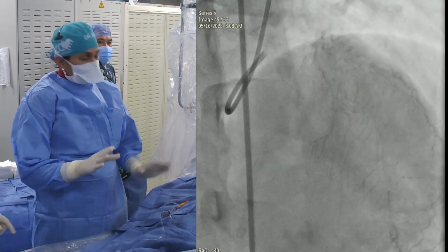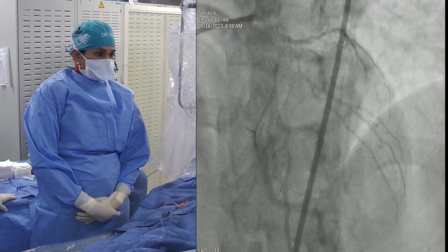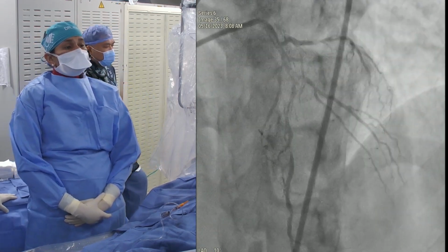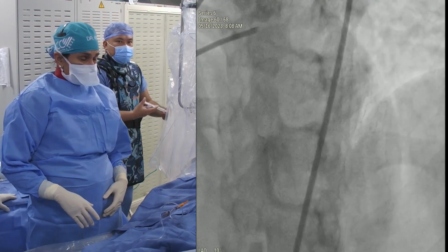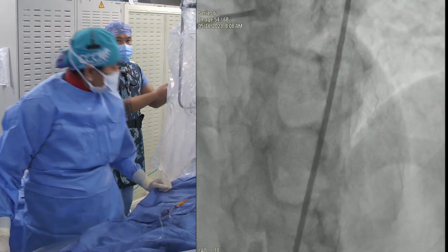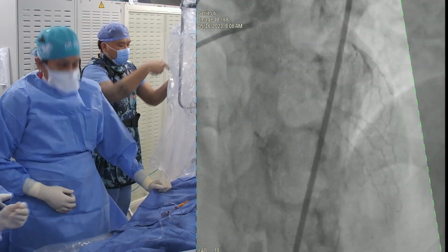Look at that. As complex as it gets. But I don't think we want to do the PCI in this view, right? No, wiring. Let's do the wire. So with that note, tell us what's the plan, Anu, and then you start. We'll take the Fine Cross and change it to rota. I think this is the case.